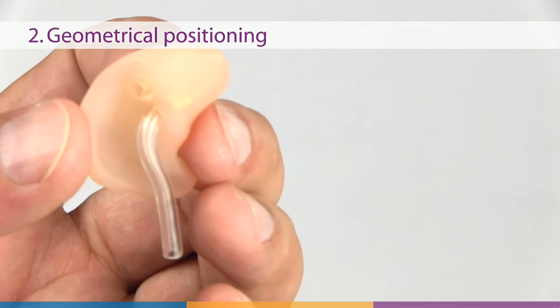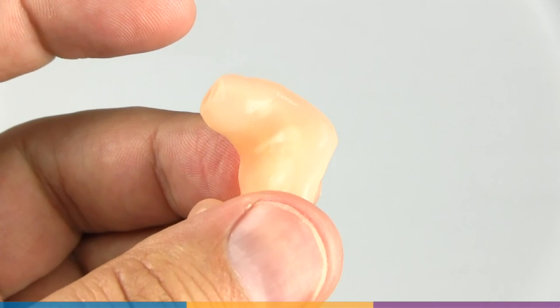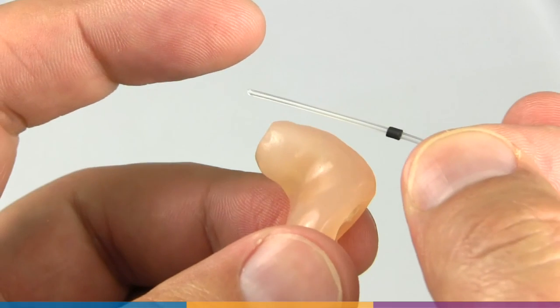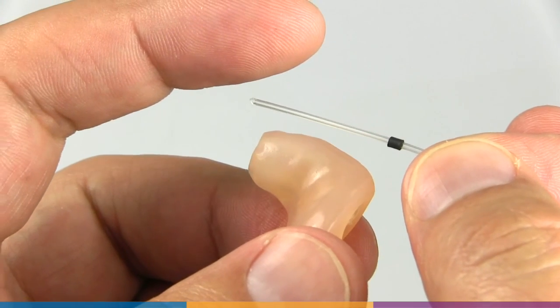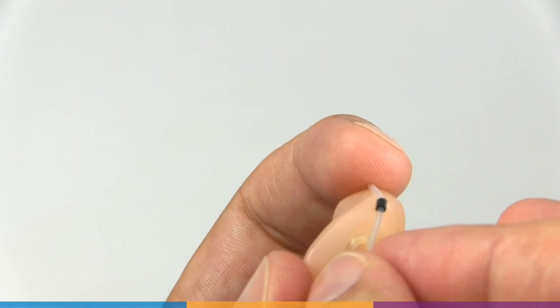Geometrical positioning may be used if you have an existing earpiece for the patient. Place the probe tube along the ridge so that the tip extends 3 to 5 millimeters beyond the medial end. Adjust the marker to line up with the external faceplate relative to the inter-tragal notch.